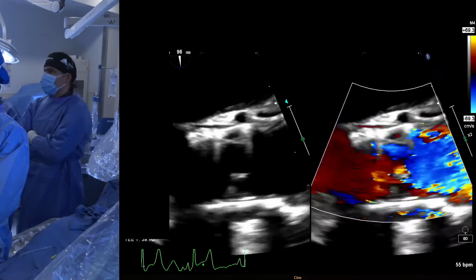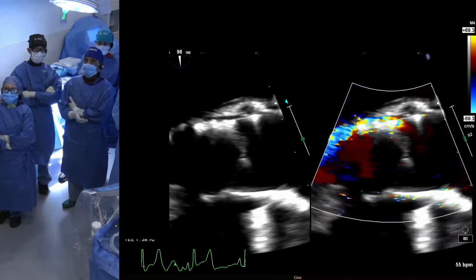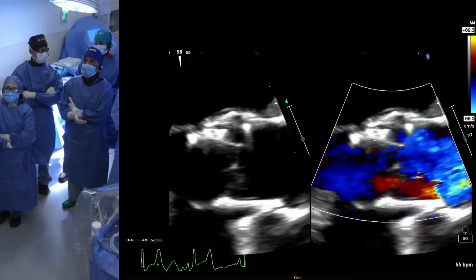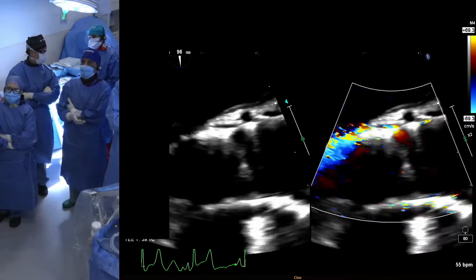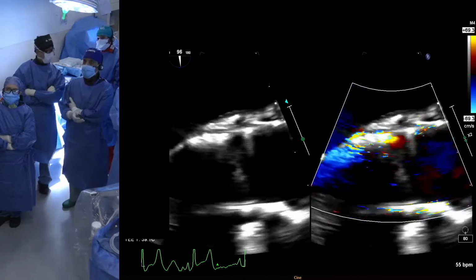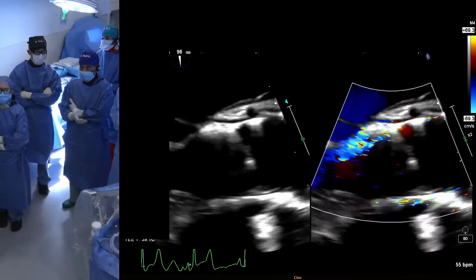But Gilbert's point was that the LVOT was larger even in the first study. So it may be that the PVL started there, but this is definitely recoil. Yeah, there's some recoil. There's a gap. I think Stan shows it nicely. So with time, with the very bulky left cusp, we have seen some of those, and we actually had to bring them back for post-dilatation and sometimes even put a second valve in if it's not sufficient.